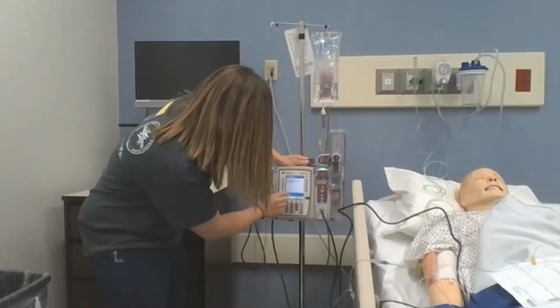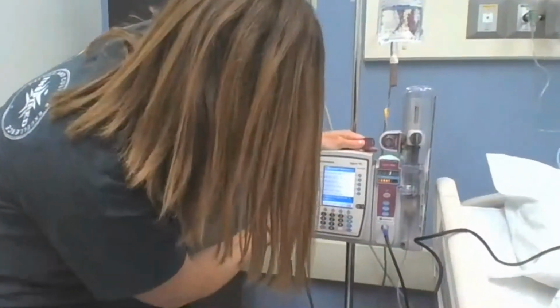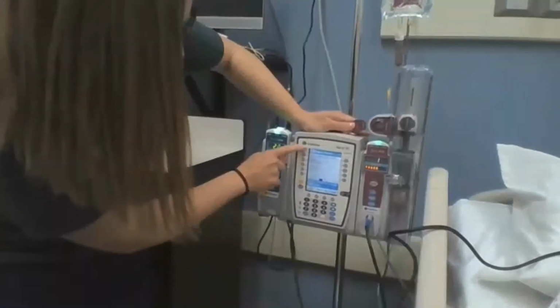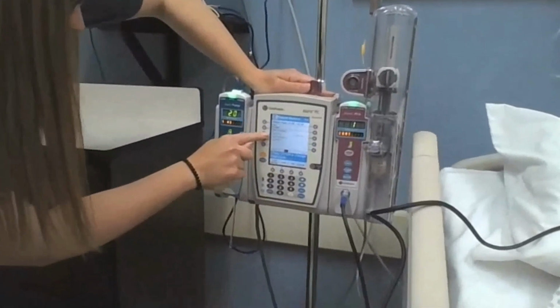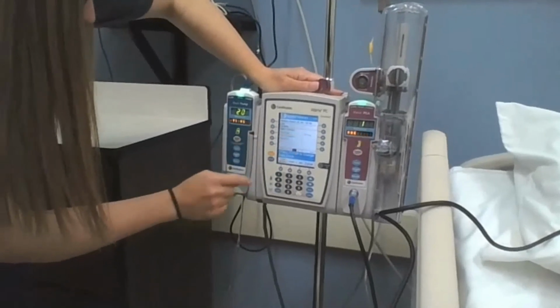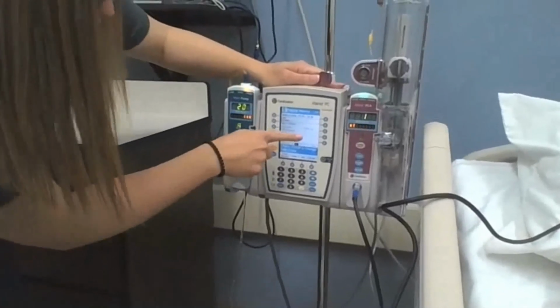But you are going to come over here and click on Channel Select and Options and Patient History. So I'm going to click on Patient History, and it's going to tell me what the history is for this PCA pump. So for my shift totals, the total drug administered is 0.203 milligrams. The total demand is 5. That's how many times they hit the button. The total delivered is 1.